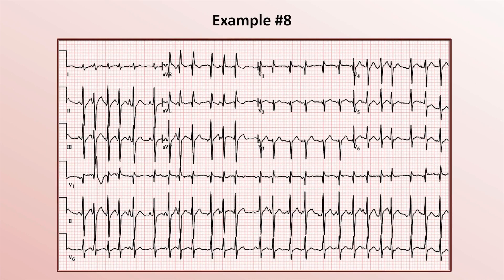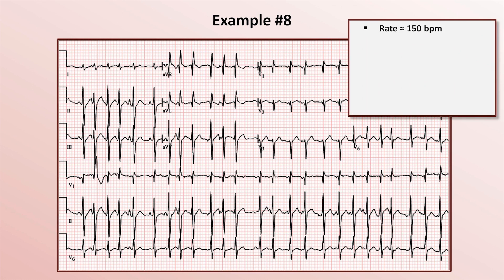Example 8. Using the 10-second rule with 25 QRS complexes across the 10-second strip, the overall rate is about 150. It's clearly irregularly irregular and narrow complex.